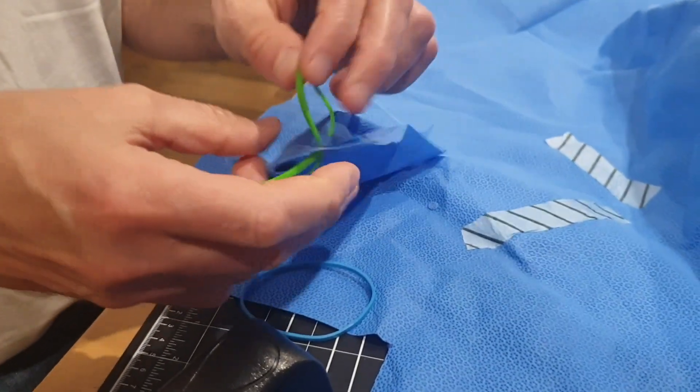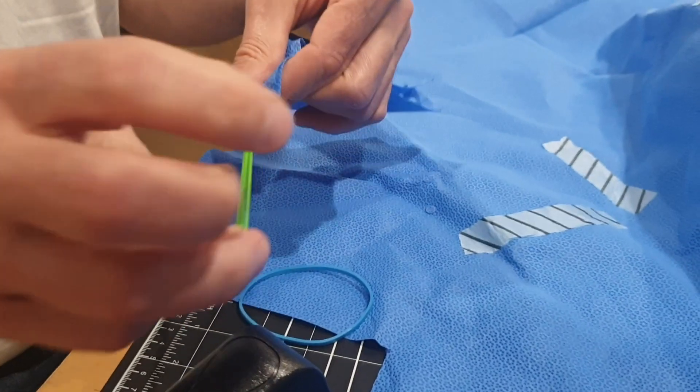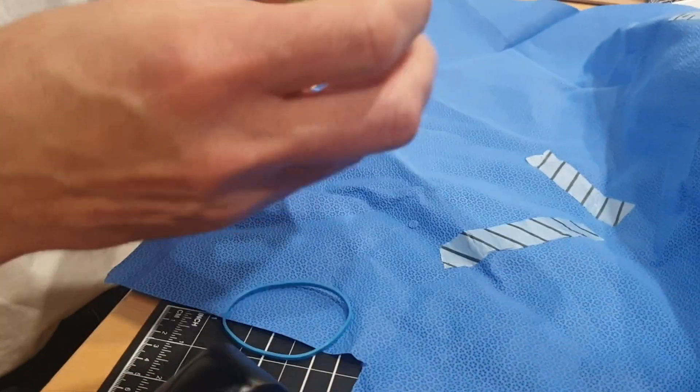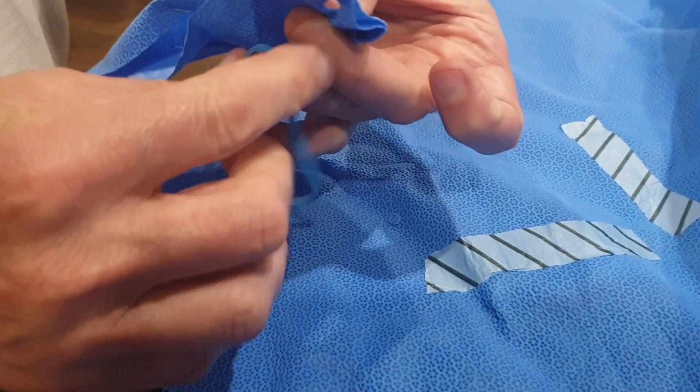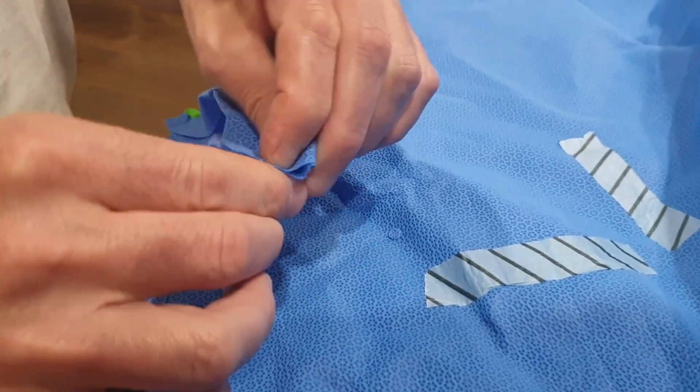Now attach the rubber bands to the mask on both edges through the holes you've created like so. These can be attached to the mask by the person intending to use it after the mask has already been autoclaved.